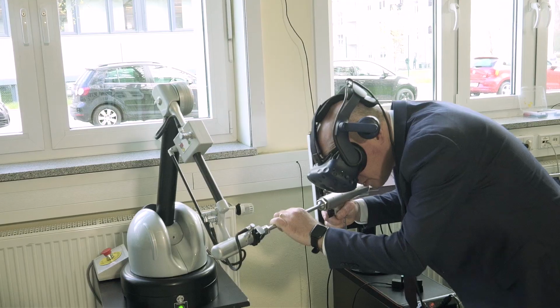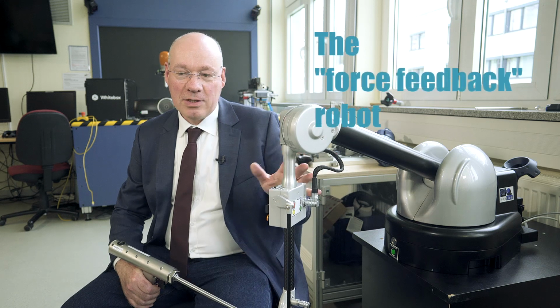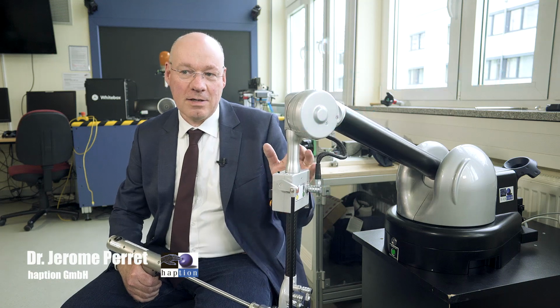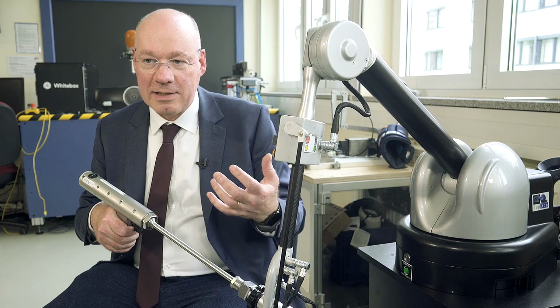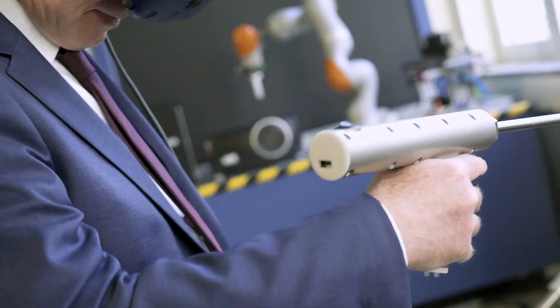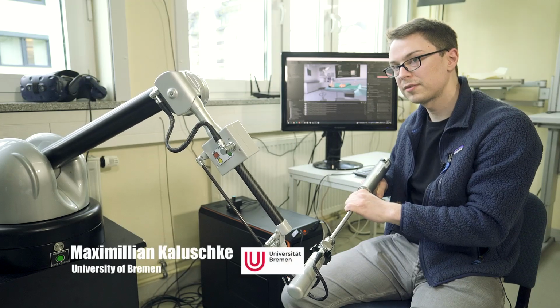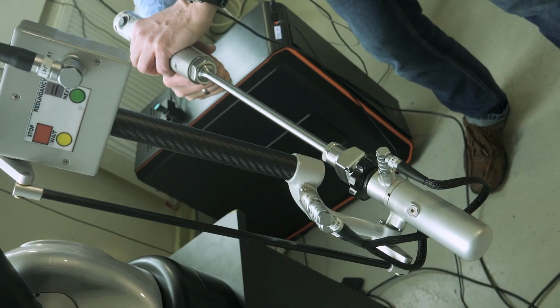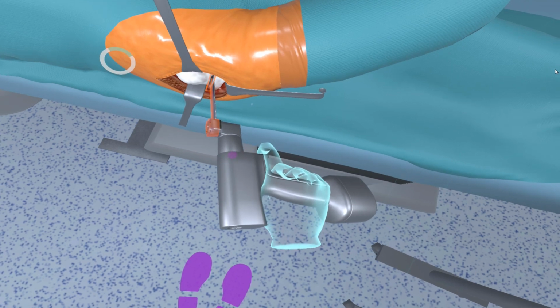And to perform the first 2 steps, we used this highly adept robot. This is a very special kind of robot. We call it a force feedback device. This robot's only function is to generate resistance so that I get the feeling that I'm really pushing against a bone. It calculates a force within a millisecond and transmits that to the robot. And then, when you come up against something virtual, you would notice the real forces.